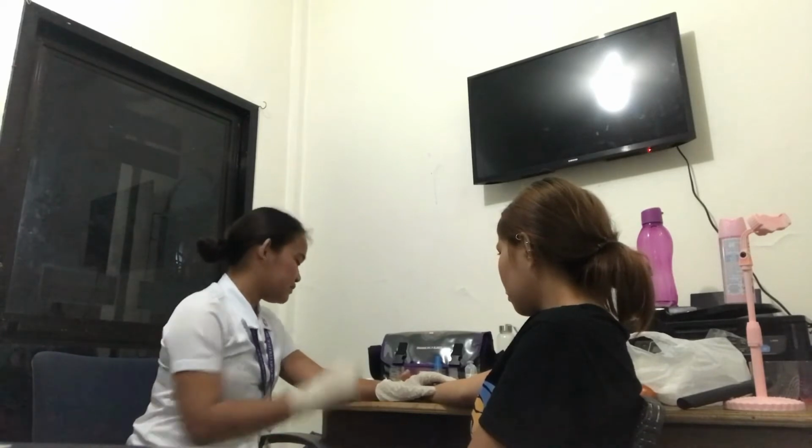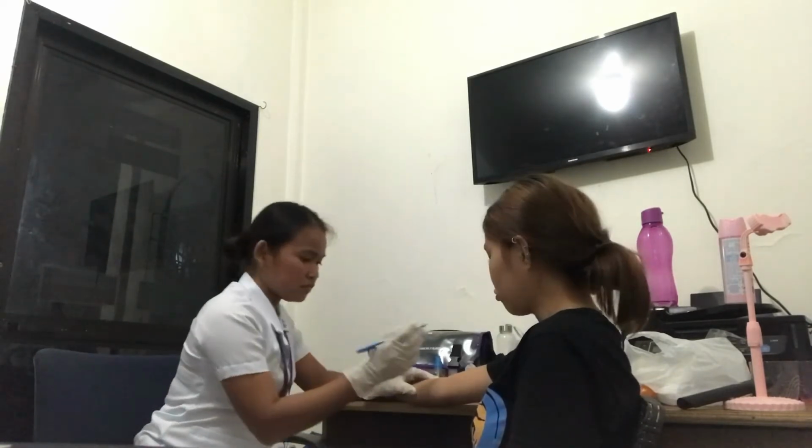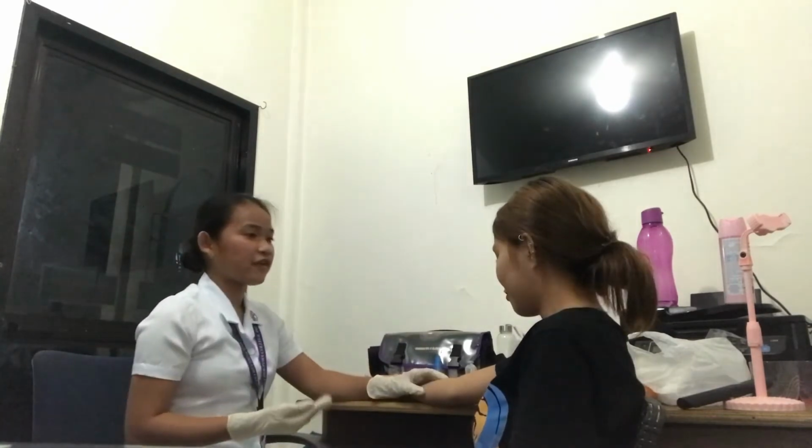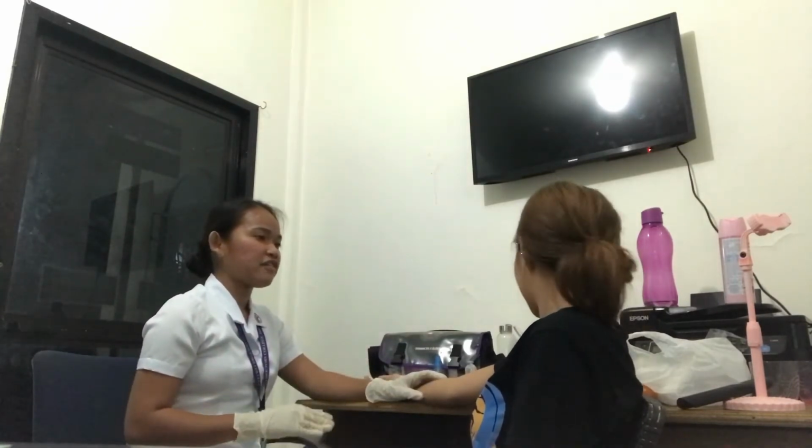After that, we need to encircle the wheal with a blue or black pen and instruct the patient not to rub the wheal or erase the mark. Ma'am, please refrain from rubbing it and erasing it, okay?